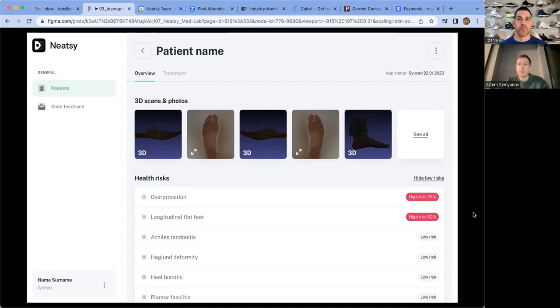You could maybe make it work for the bell curve, but the tails on each end are going to be a challenge. If you did it AI driven, you'd probably get it right maybe 60% of the time, pretty much the same as an over-the-counter one. Most people feel better in an over-the-counter one because it gives them a little bit of support, but you can't do anything really functional or biomechanical with it. So you would still need to bring them in the office to evaluate the biomechanics. But let's say you had an AI driven 3D printed $50 or $100 one all day long.